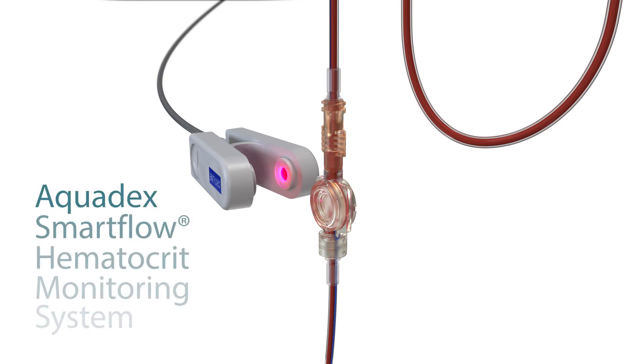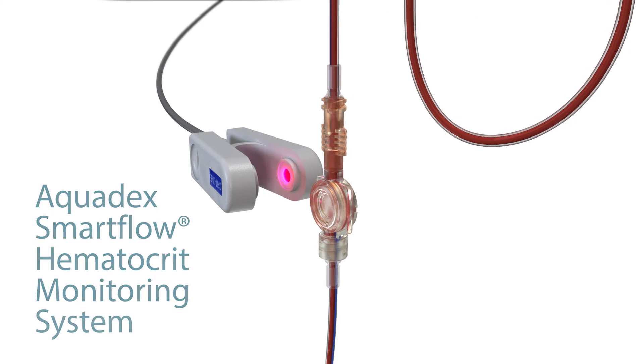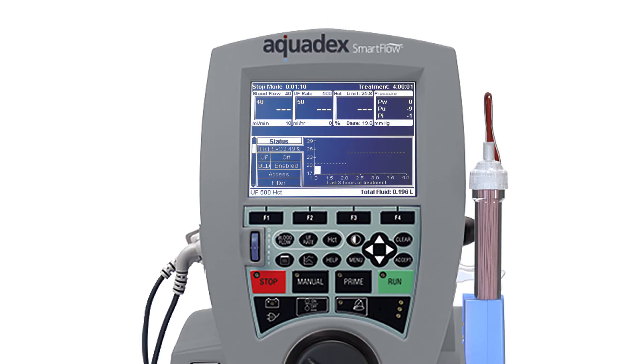An important safety feature of the Aquadex system is the hematocrit monitoring feature, which uses a sensor that attaches to a blood chamber on the withdrawal side of the circuit, pre-filter, and measures the percentage of red blood cells in the patient's blood. As excess plasma water is being reduced, the hematocrit should increase. The hematocrit sensor allows for consistent monitoring throughout the therapy, helping to ensure that fluid is not removed too quickly.